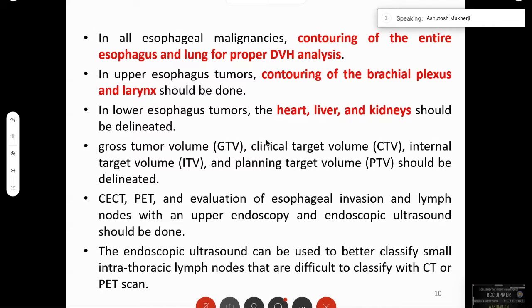In addition to the heart, I contour the left ventricle as well as the left anterior descending and the left circumflex arteries. The reasoning is that the left ventricle is where the pumping action of the heart takes place, so I would not like any dose hot spots in that region. I use the left ventricle as a higher constraint area within the heart so that higher dose regions are limited to the atria or great vessels — basically pushing the dose to the middle and posterior end.